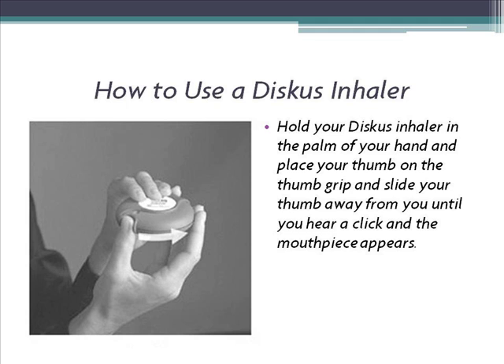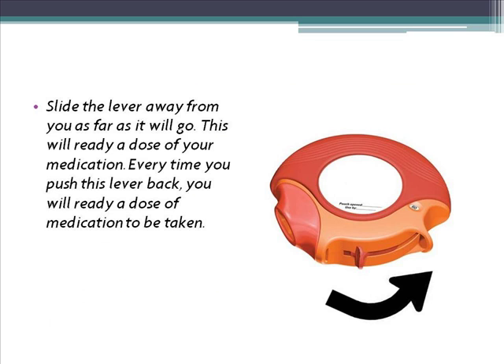2. Slide the lever away from you as far as it will go. This will ready a dose of your medication. Every time you push this lever back, you will ready another dose of medication to be taken.